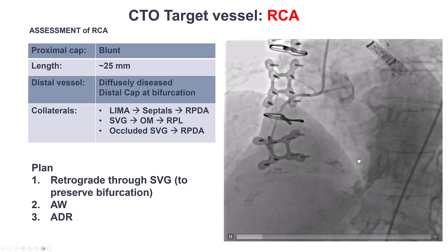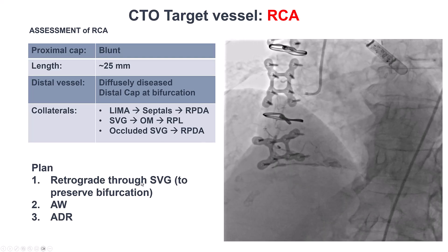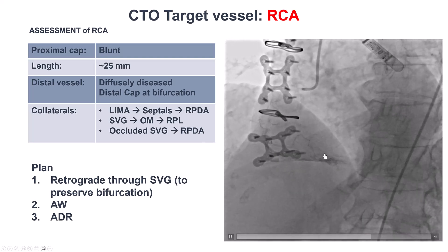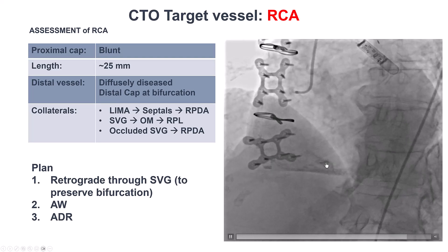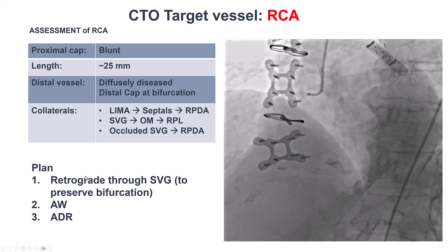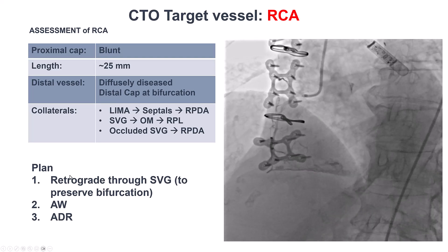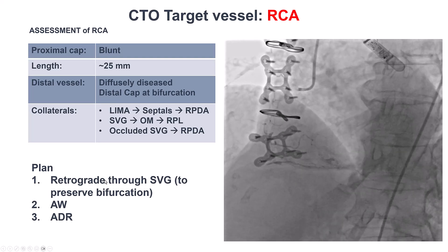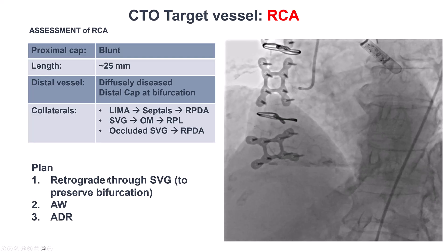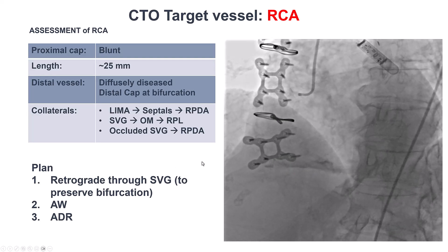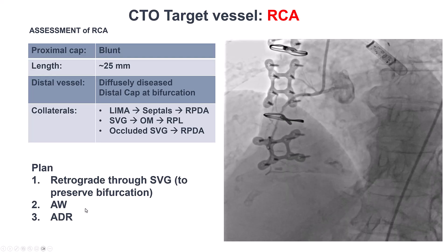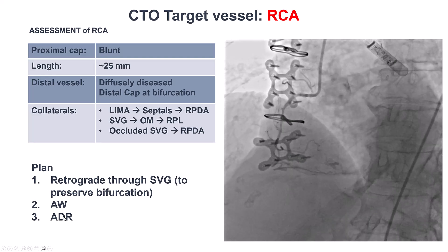Given the bifurcation of the PDA/PLV and the diffuse disease of the distal vessel, our plan was to go retrograde — a primary retrograde approach through the occluded saphenous vein graft. If that didn't work, we would try to go antegrade.